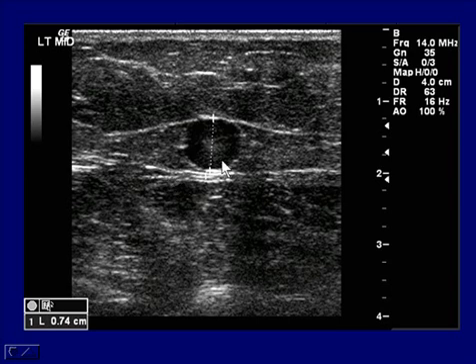However, there are numerous tributaries, secondary branches, that will move up and out of this plane. They can have venous insufficiency and need treatment as well. So it's important to identify tributaries versus the main trunk, and the main trunk usually lies in this fascial plane.